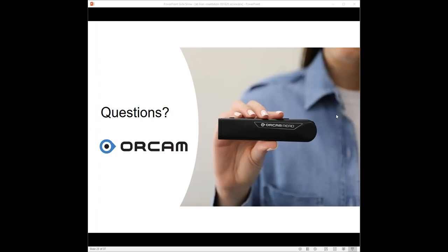A couple things I'd like to add with the MyEye. Because it is a wearable device, it predominantly uses the touch bar on the side to manipulate the device. It also uses three key hand gestures. One is using your index finger to point at whatever you want, pointing upright. The other one is if you want to stop reading, you put your hand out as if you're saying stop, the way Eve is doing it right now. And then the final one is you put your wrist out and it will tell you the time.